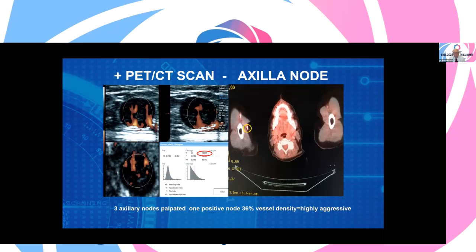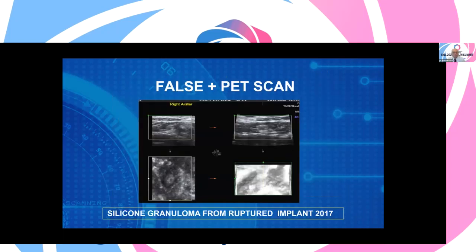What we are able to do, because once you see it, we can stick a biopsy needle in and sample the cells just to confirm, or you can stick a laser needle in and destroy it, or any of the other focal treatment ablative technologies. They all work. It's a surgeon's choice and patient's choice, of course. Next slide, please.